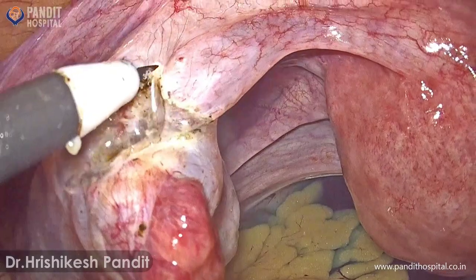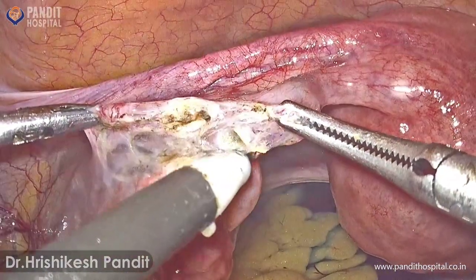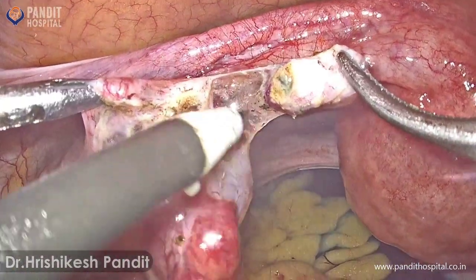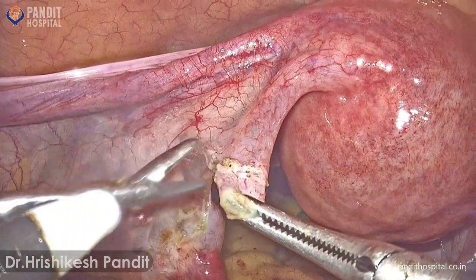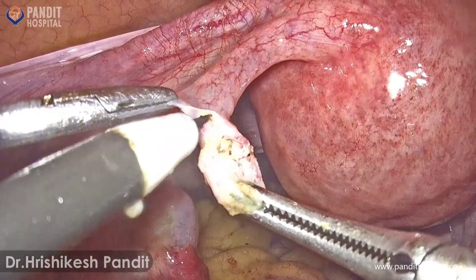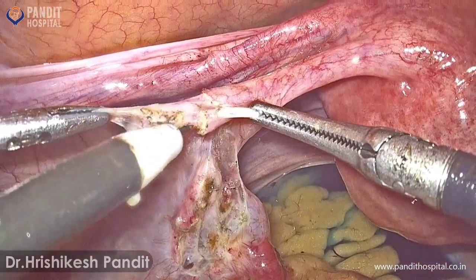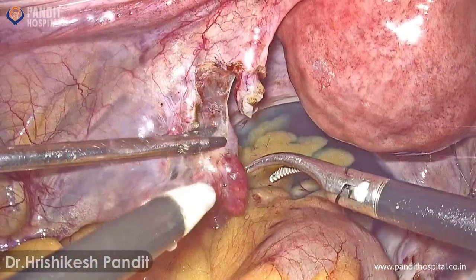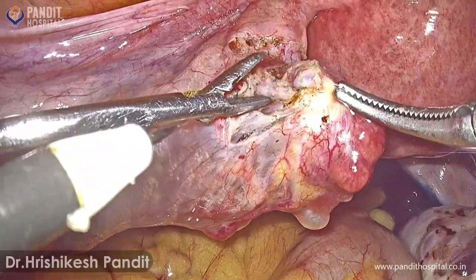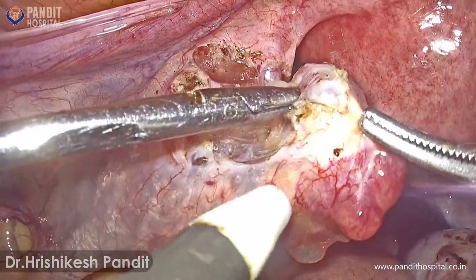There is a lot of fibrosis seen on the left side along with a cyst. Here I accidentally punctured the tube, but for the final cut we are going to use scissors. We are just cutting the serosal layer by pulling the mucosa and muscular layer. That is the cyst which is over the fimbrial end, so first I am restoring the anatomy.